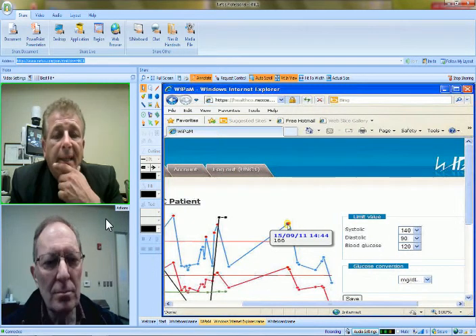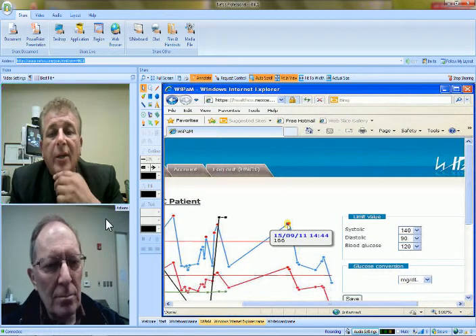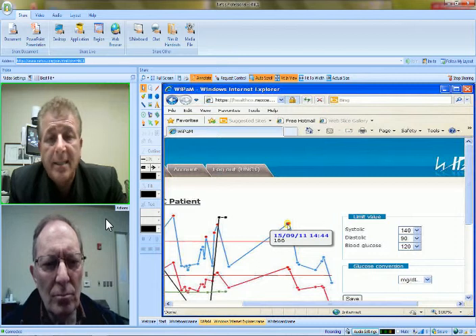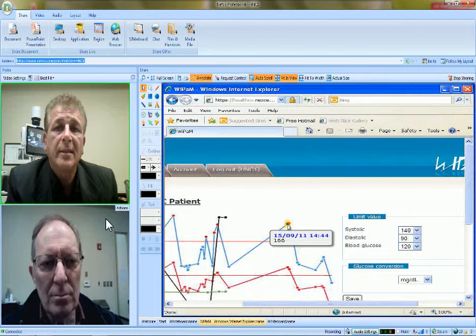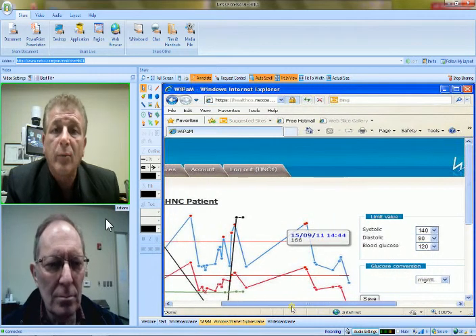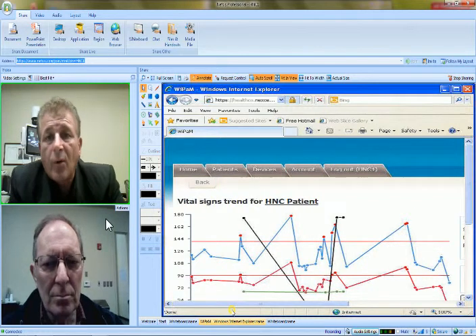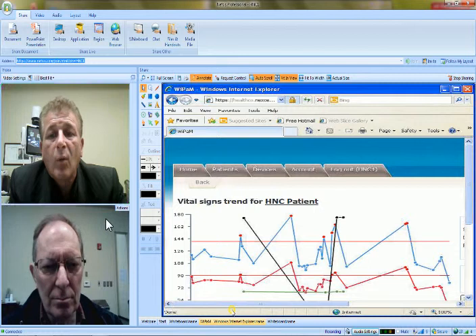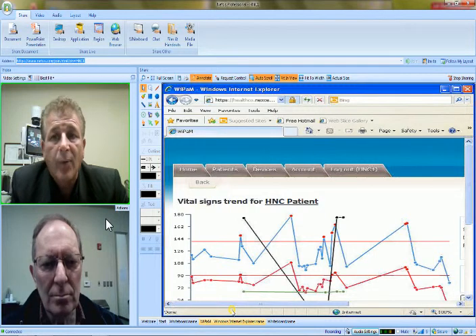So right now I've highlighted, and I see at 2:44 in the afternoon, Bob, your systolic was at 166, and maybe this just happened yesterday. So it gives me an opportunity now to triage this before it gets out of hand and Bob shows up in the emergency room and readmits. So I can say, Bob, you know what, you were doing really well, but you were at 166 yesterday. What happened? Did you take your meds? Did you just finish chasing the dog out the door prior to taking your reading? Did you eat breakfast? Were you exercising?